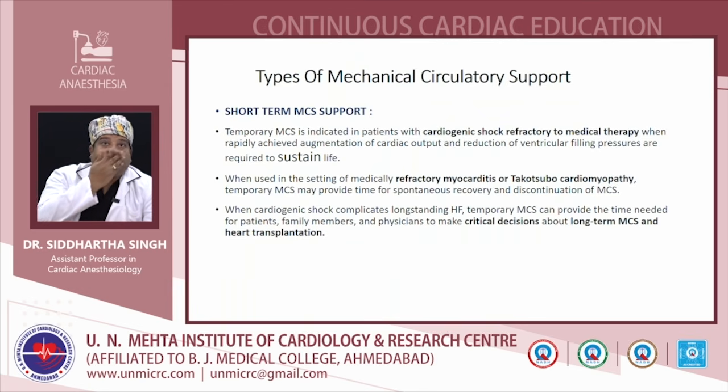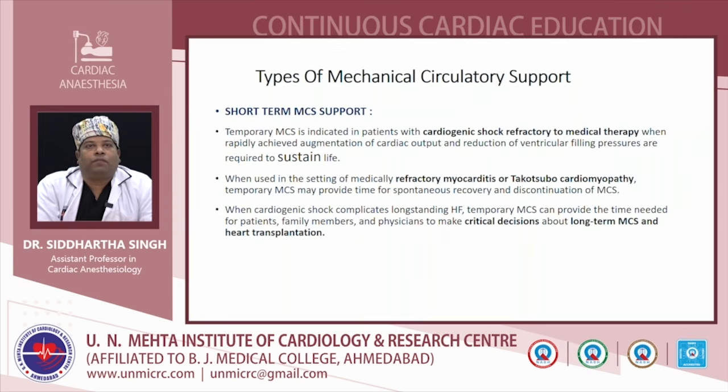Types of mechanical circulatory support. Coming to short-term mechanical support, this is a temporary mechanical support indicated in patients with cardiogenic shock which are refractory to medical therapy, when rapid augmentation of cardiac output and reduction of ventricular filling pressures are required to sustain life. So it is bridge to recovery.